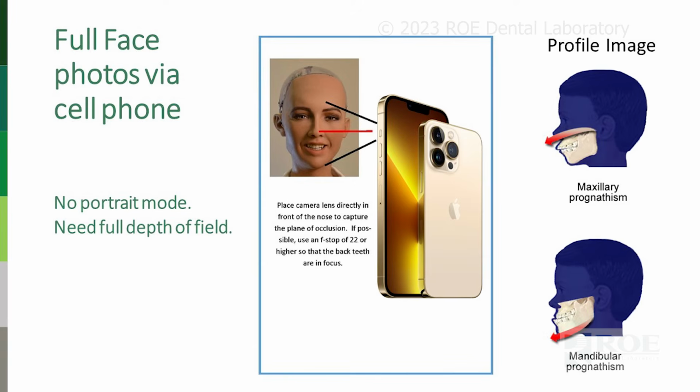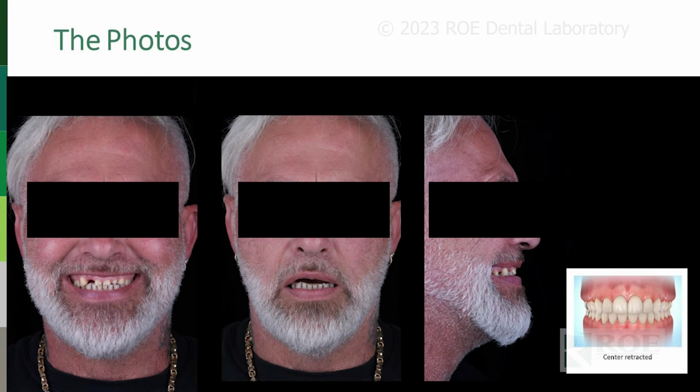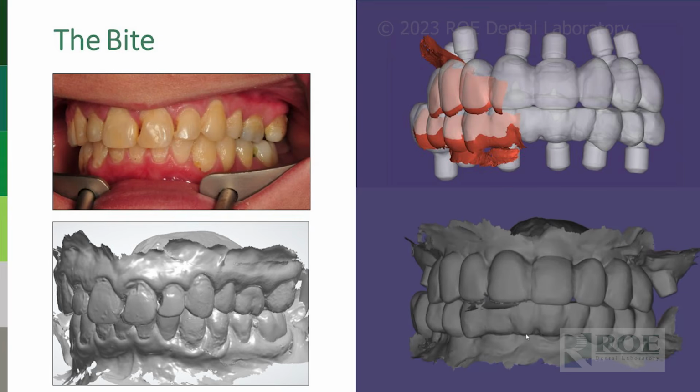Thank you. If we are dealing with overjet, overbite, or lip support, where we're changing a patient drastically, take a couple of profile pictures too. It helps a bunch. Full face, full smile, even exaggerated. Another picture that's overly exaggerated would be nice so we can know the transition line. Have the patient say the letter E, or almost lips together at rest, and then a profile. Good. And send us a couple of retracted pictures in occlusion, so we can really verify the bite. Those are the photographs.